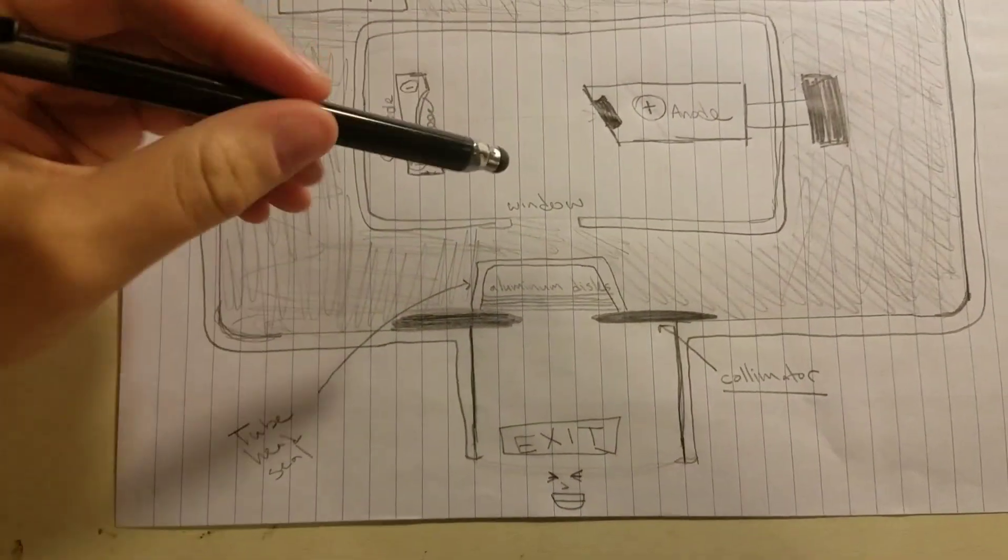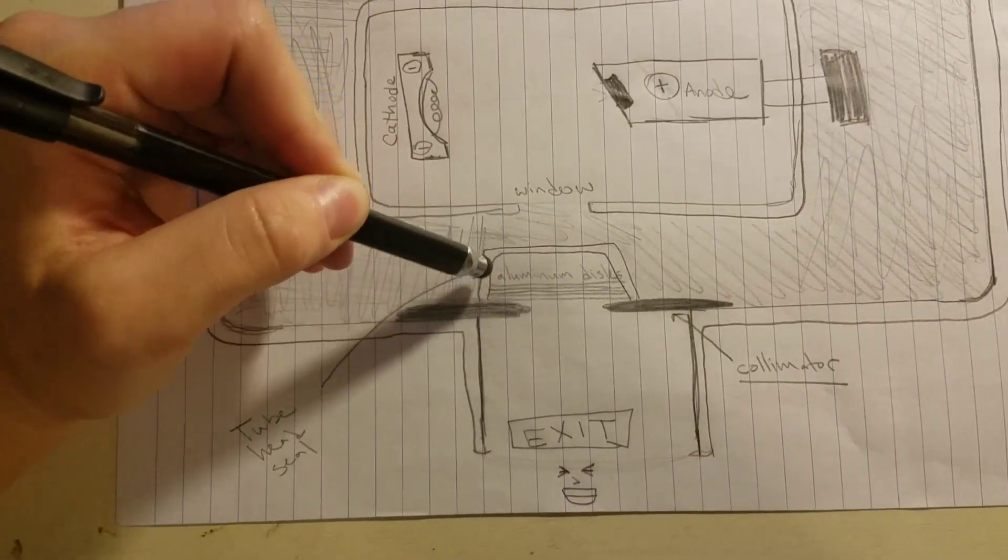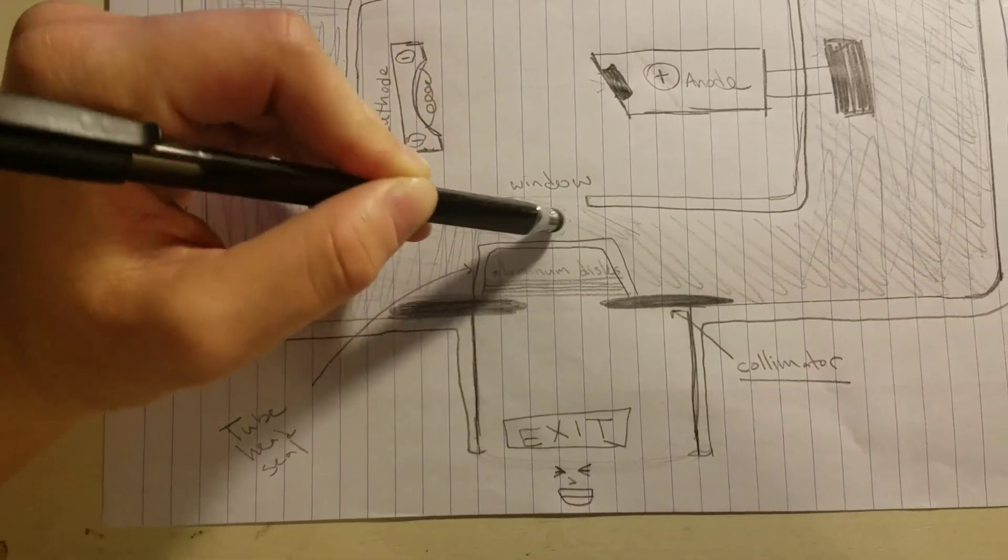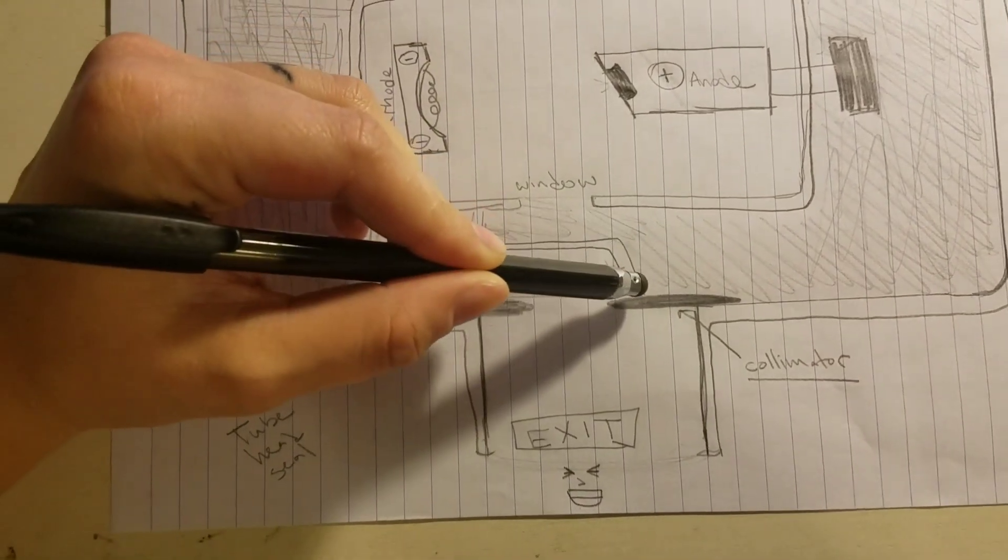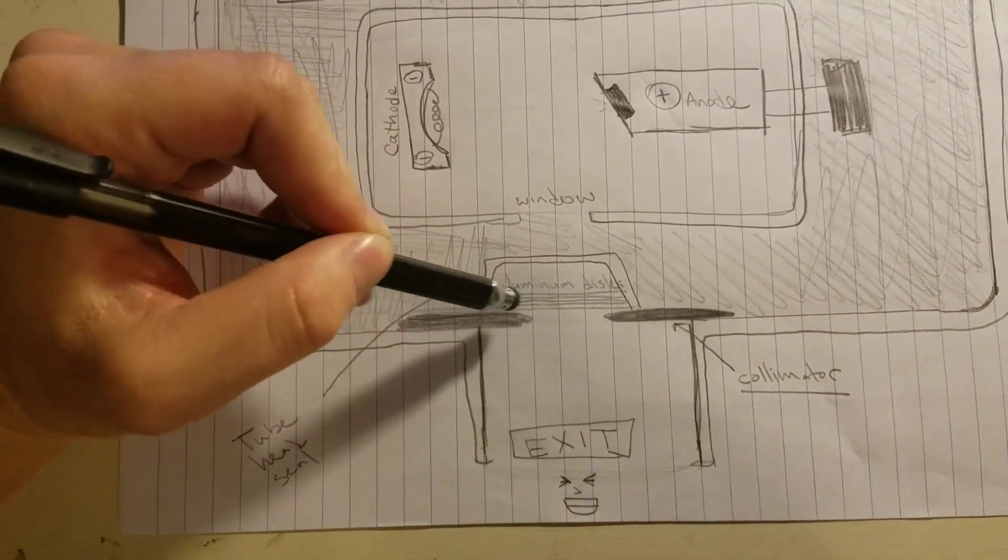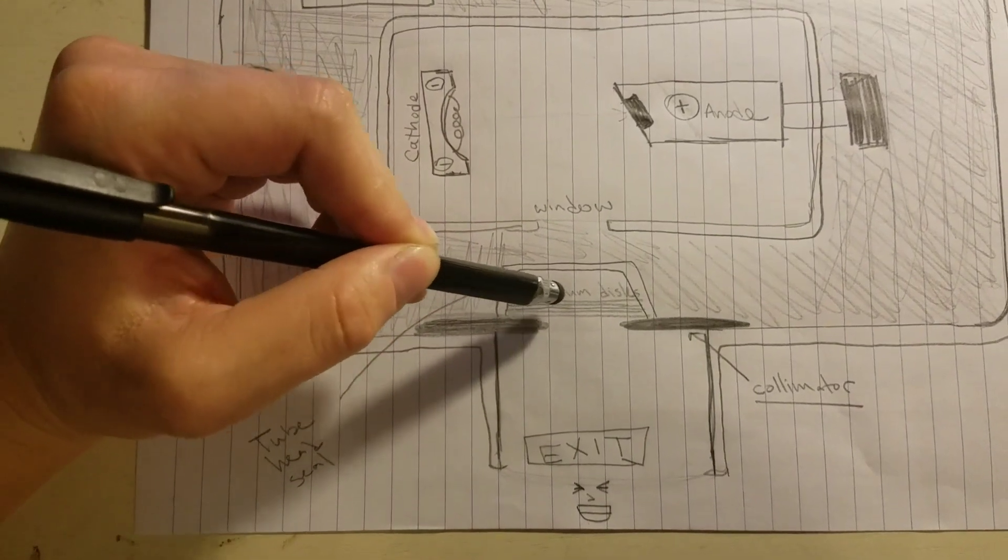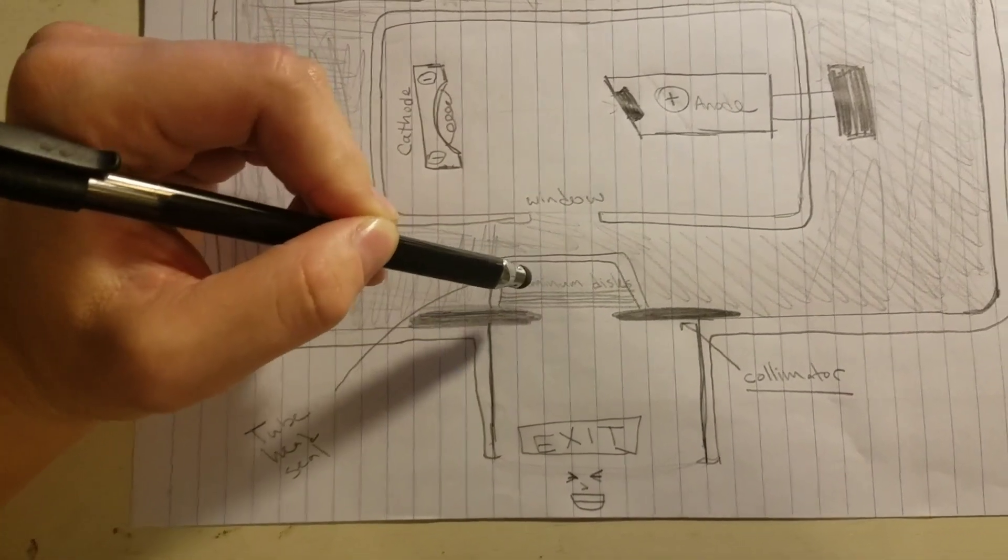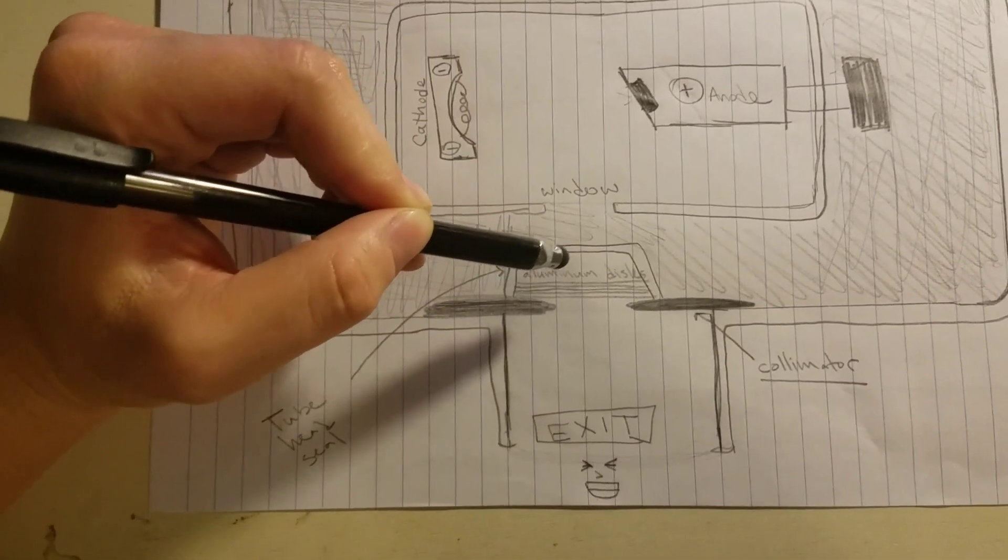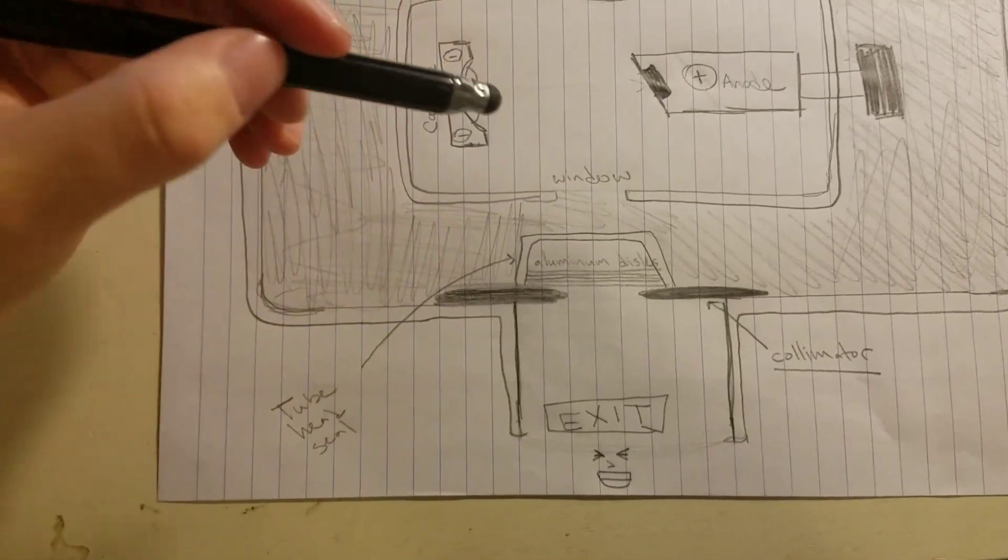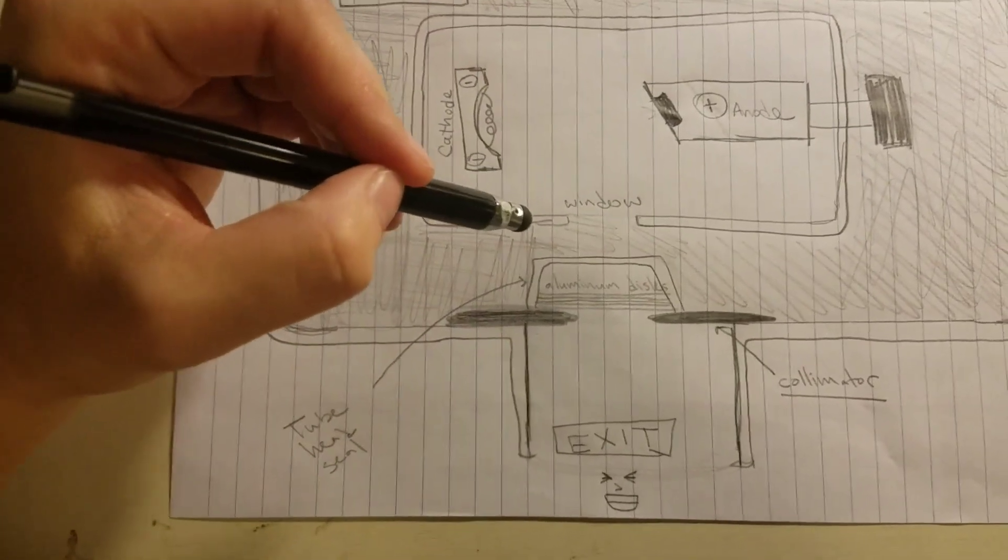The aluminum is what filters out—so this is the tube head seal, and then the aluminum filters here is what filters out the soft x-rays or the long wavelength x-rays. We want the strong short wavelength x-rays only.